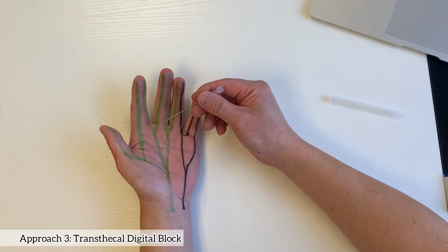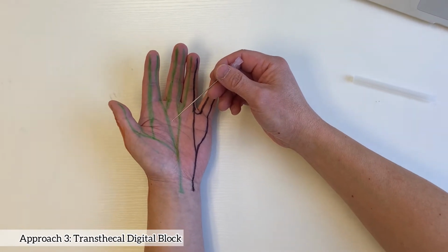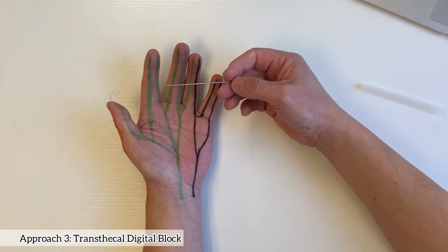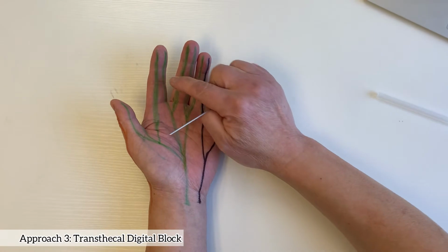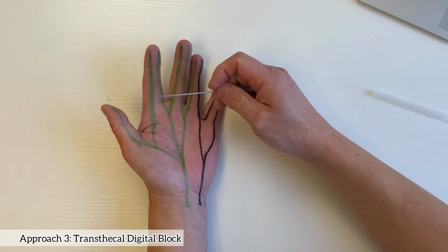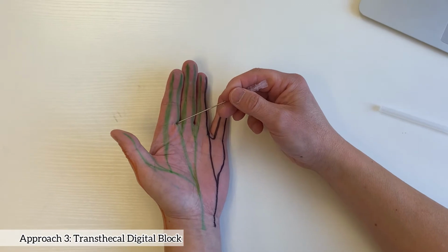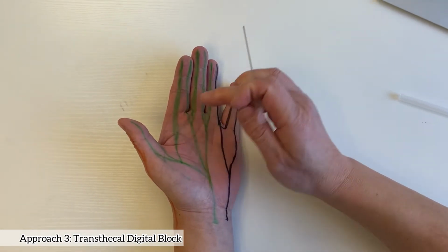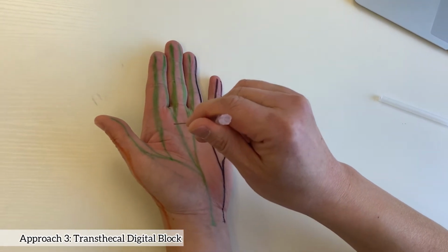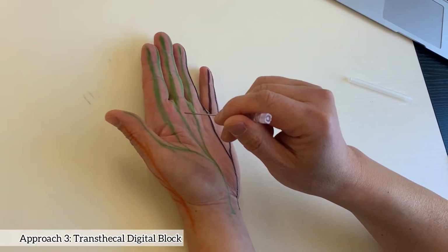Okay, I'm going to talk about transthecal digital block. So place the patient's hand with palm facing up on the table and locate the flexor tendon. You can feel the tendon or have the patient move the fingers. This is the palmar crease. This is the MCP crease. So just distal to the palm crease, angle your needle at 45 degrees, advance the needle, and inject local anesthetic.